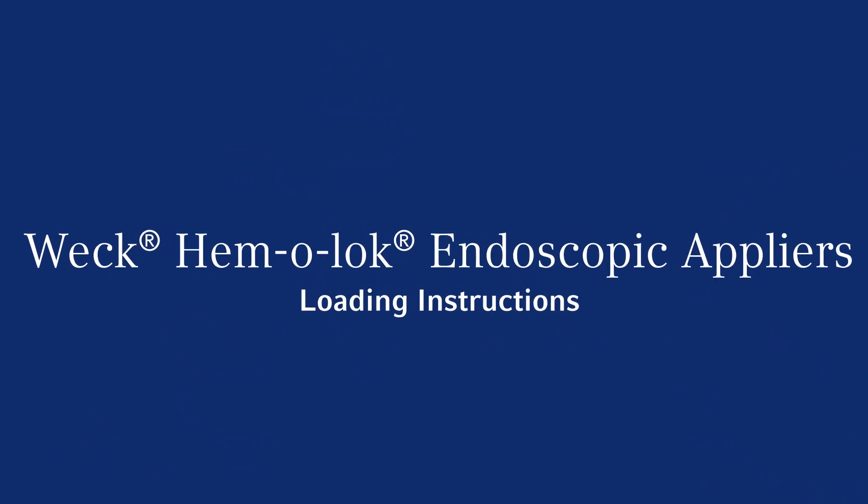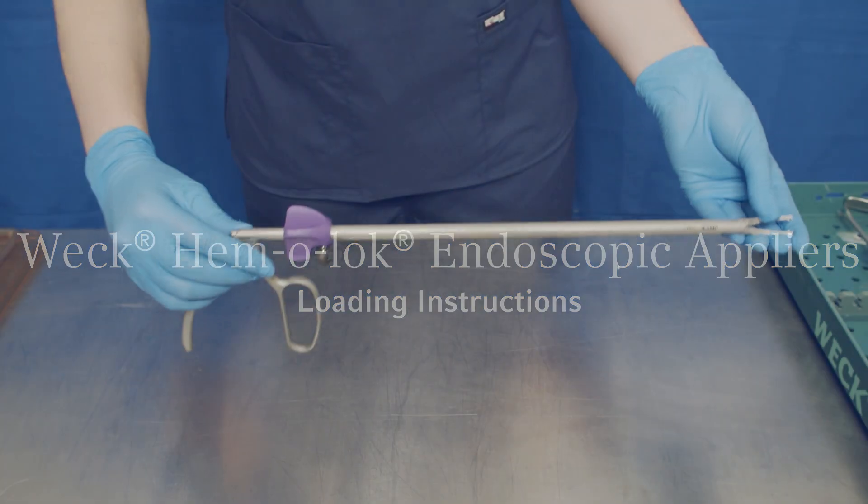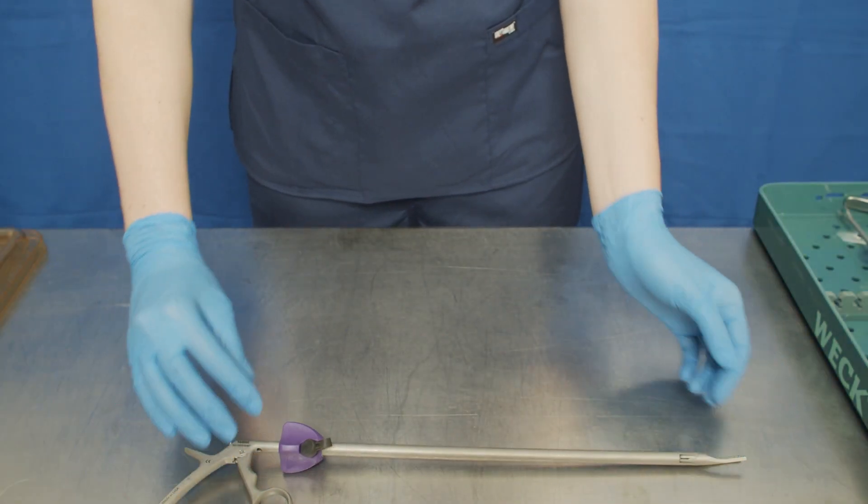Trusted by surgeons for over 50 years, WEC ligation systems help you ligate with security and confidence. To load a WEC clip into your manual endoscopic appliers, follow these instructions.